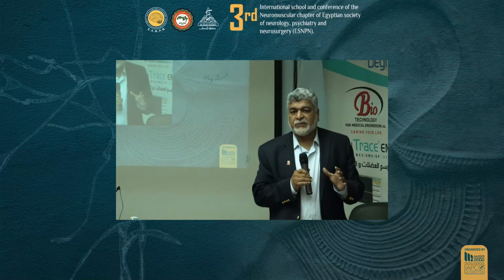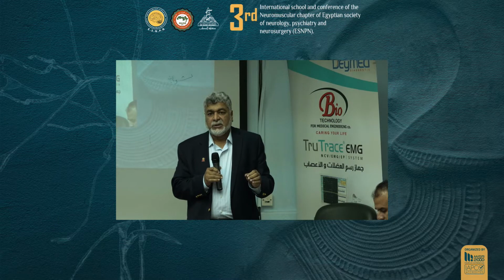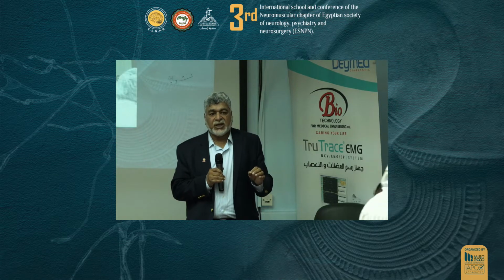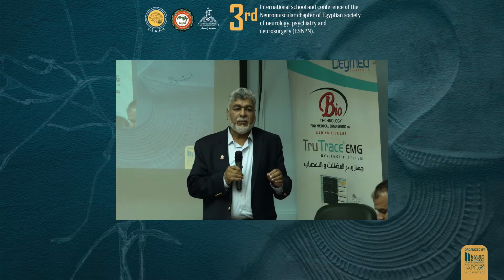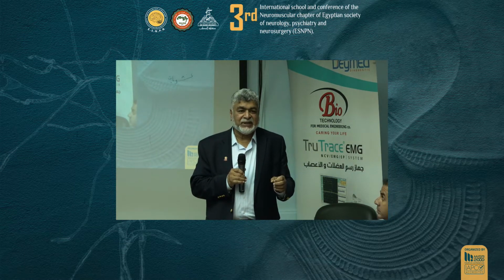That's the most important principle of all the things, of course. There are a number of things I want to show you, but what was covered was recruitment of motor units. It takes time to learn because that's the most sensitive indicator of a myopathic versus neuropathic process. To be able to judge the recruitment of motor units, and I'll cover that principle a lot today. I'll show you examples of abnormal findings, all the things which I've covered. If you have enough time and you're still awake, I'll show you each and everything, okay?